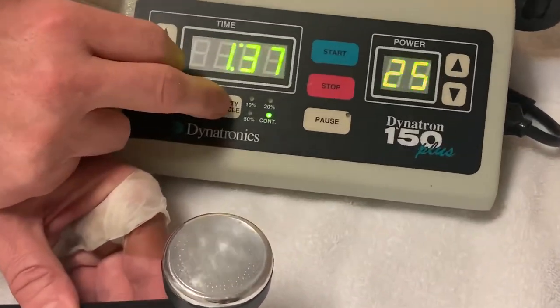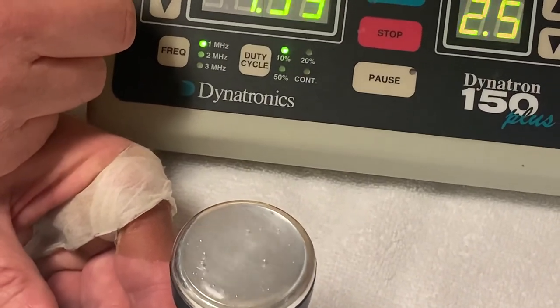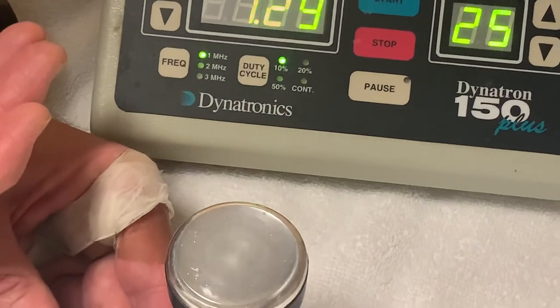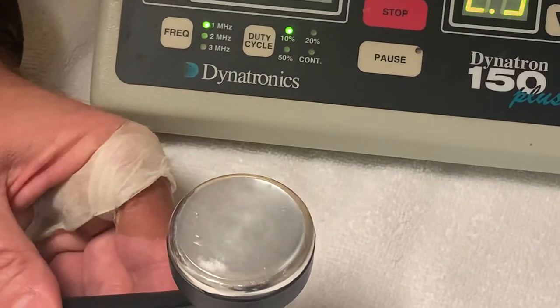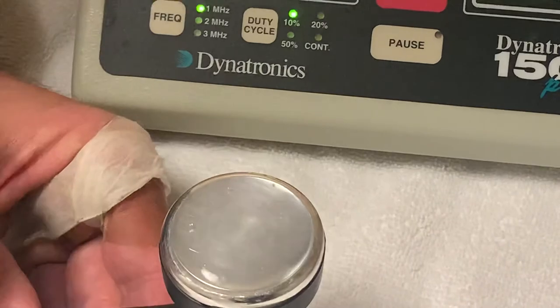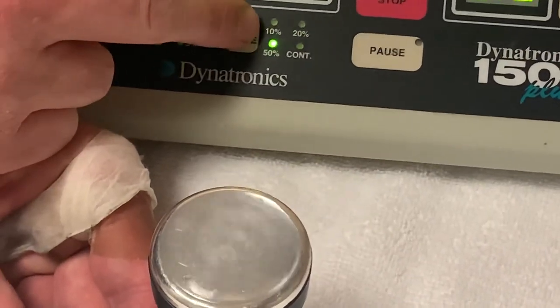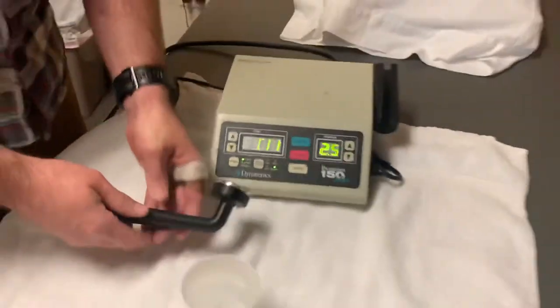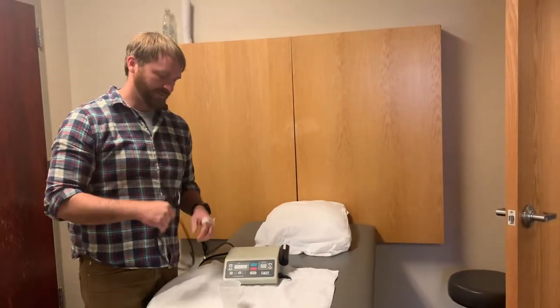If we switch to a duty cycle of 10%, you can see how we get nothing for a few seconds and then it comes on. You can see how the spread is a little bit bigger between those bubbles compared to continuous ultrasound. So that is all for ultrasound lab — I hope you've enjoyed it.